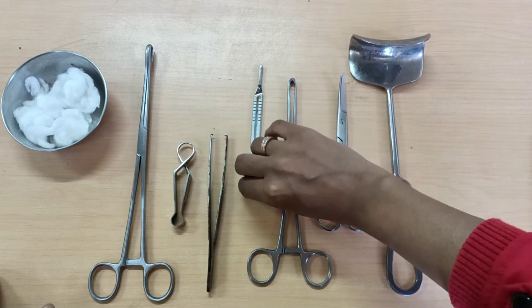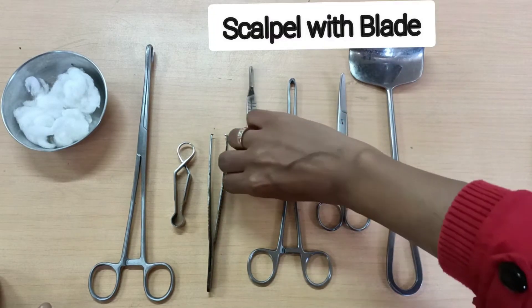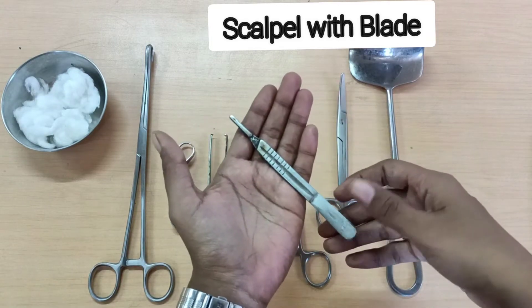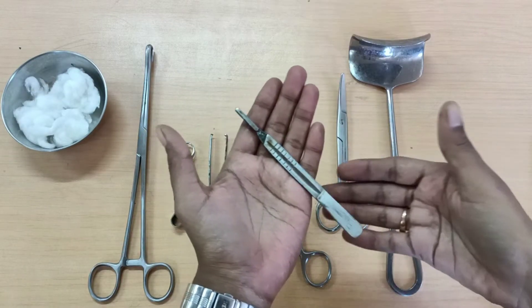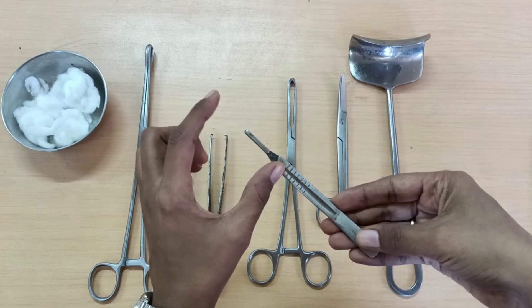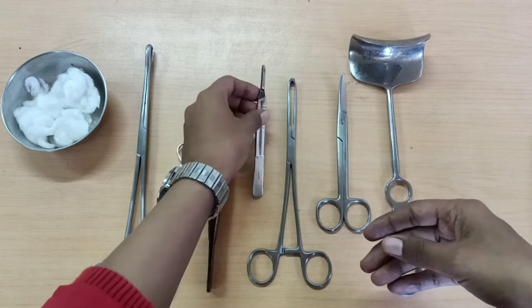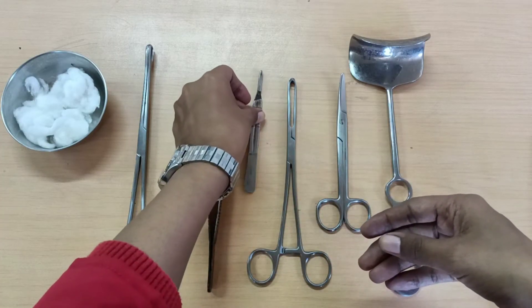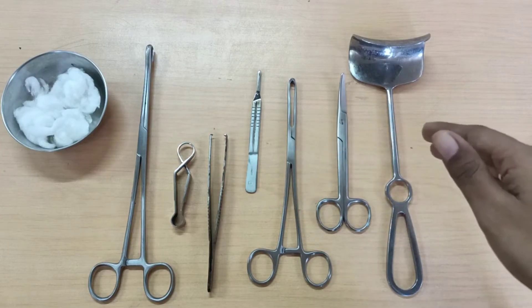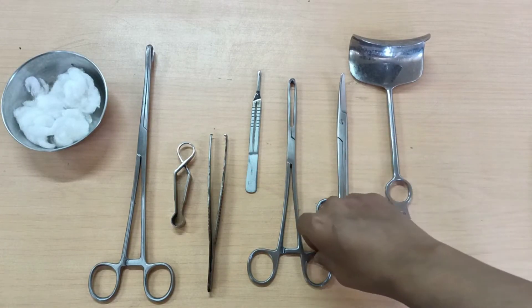Next, are you ready to give the incision? You require a scalpel with a blade, and the blade we most commonly use is a number 23 blade. You first incise the skin, and then you have fat, and then you have your rectus sheath.